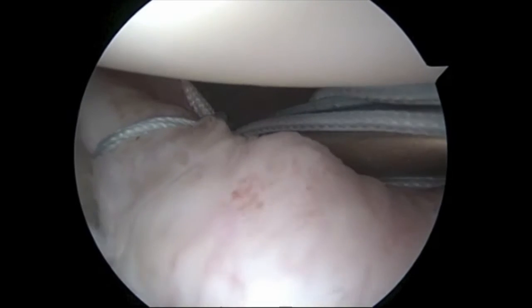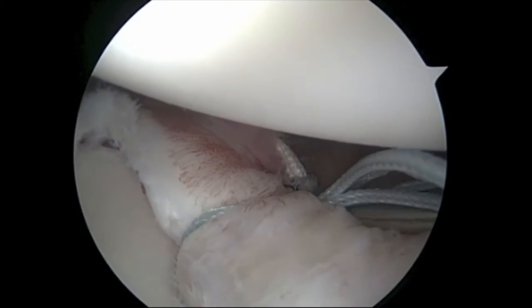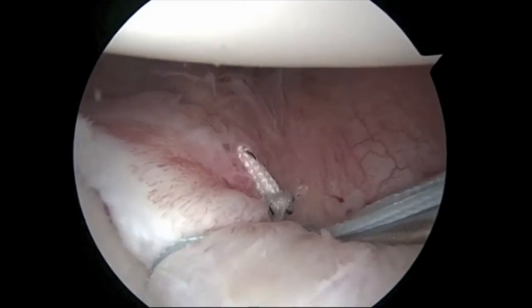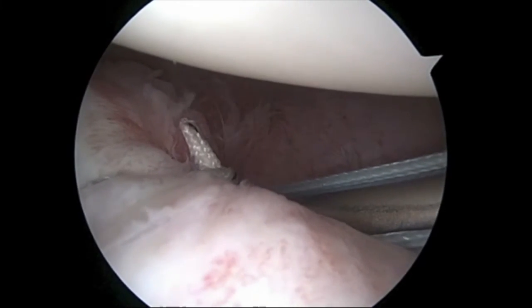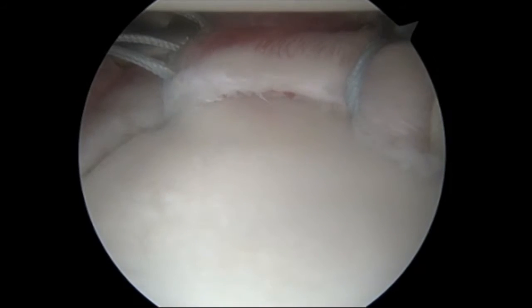So we bring our knot tier in and we work these knots down to secure the labrum and ligament back up onto the socket where it belonged. Once we get that tied, we then cut excess suture and we repeat the process.